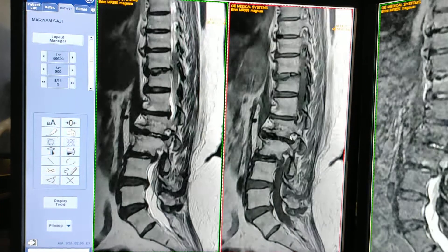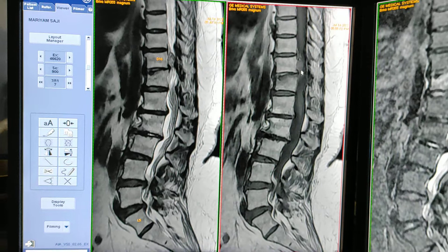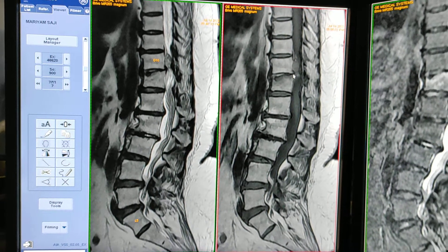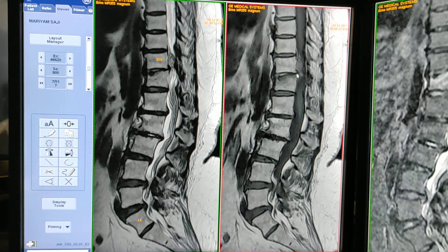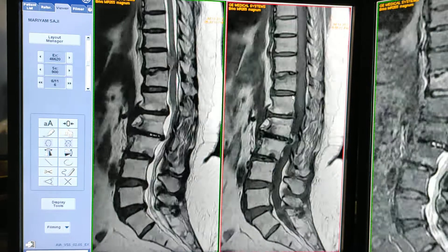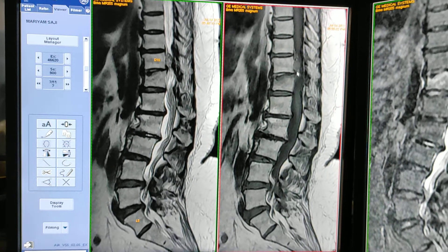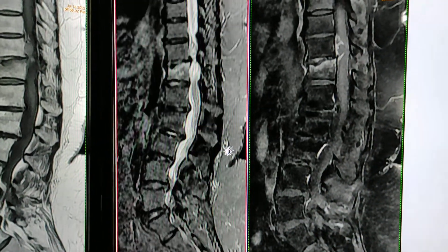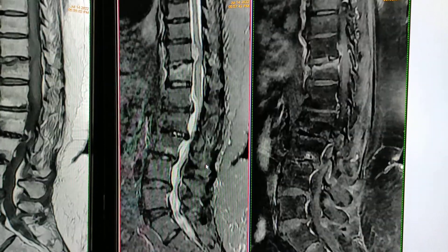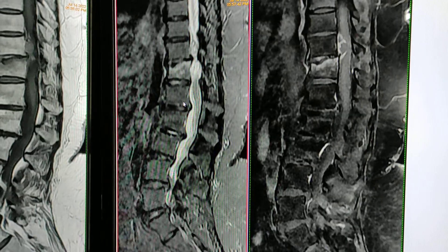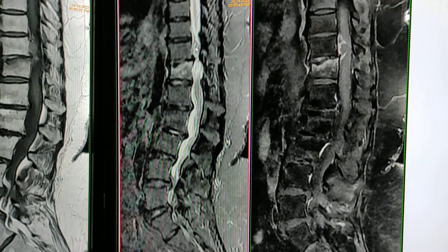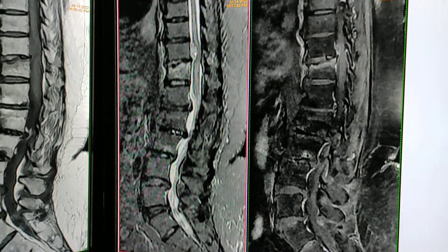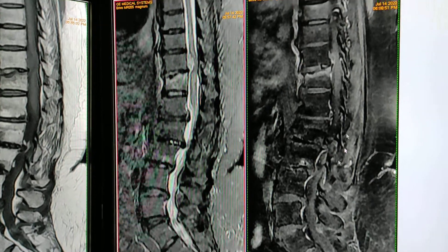On the D10 level there is a hyperintense lesion on T2, and the second sequence is T1. On T1 it is iso-intense. This is a small lesion, size approximately one to one-and-a-half centimeters. Going right to left: T1 iso-intense, T2 iso-intense. Now this is the STIR sequence — also iso-intense.